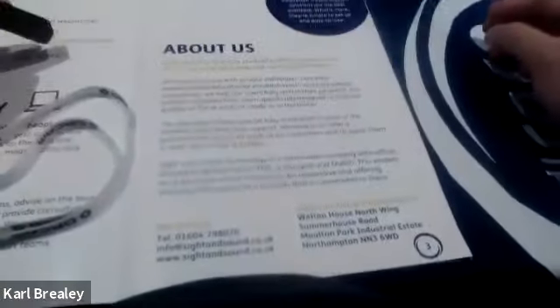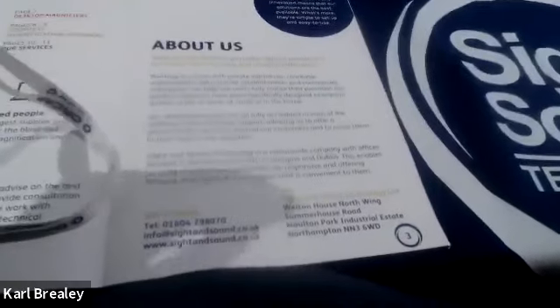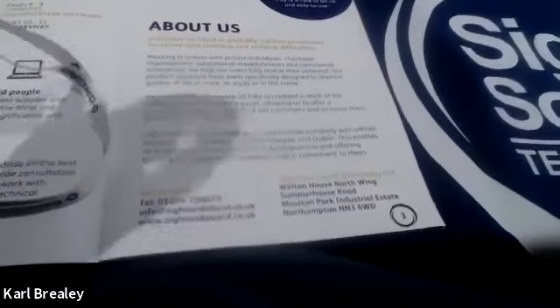Now you see, the second time I snap that, it's almost like it's learned itself that it may not have got it right the first time, and the second time it's read it exactly as it appears on the screen. Good. Okay.